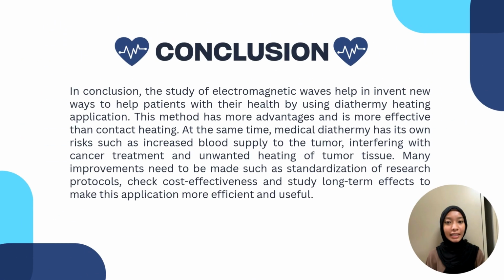In conclusion, the study of electromagnetic waves helps in inventing new ways to help patients with their health by using diathermy heating application. This method has more advantages and is more effective than contact heating. At the same time, medical diathermy has its own risks such as increased blood supply to the tumor, interfering with cancer treatment, and unwanted heating of tumor tissue. Many improvements need to be made such as standardization of research protocol, check cost effectiveness, and study long-term effect to make this application more efficient and useful.